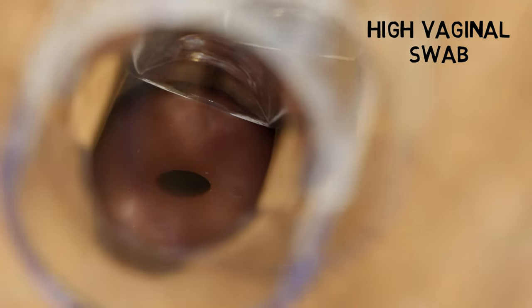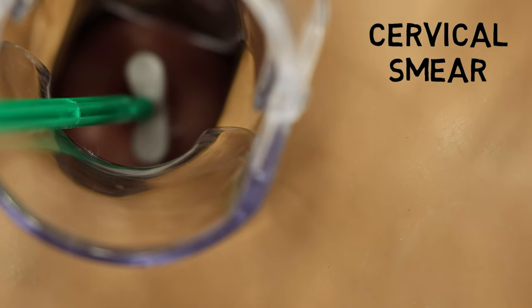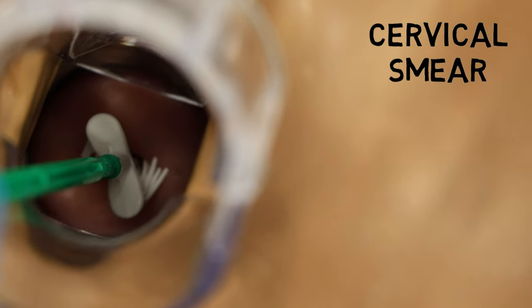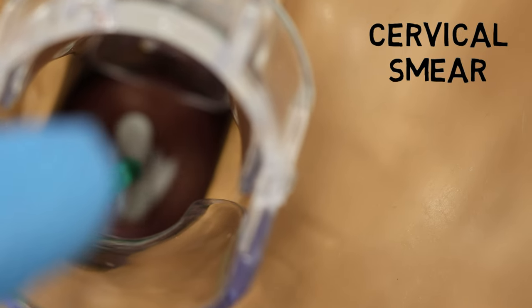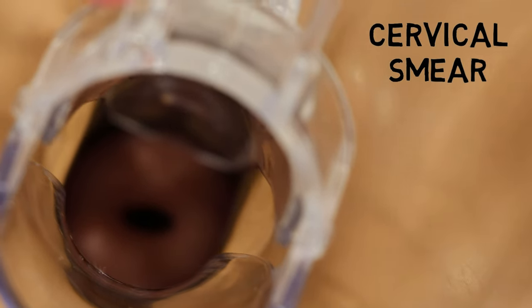Here we're taking a cervical smear using a cervical broom. The tip is inserted into the cervical os and is brushed in a circular motion over the cervix by 360 degrees for five turns. Some pressure should be applied to make sure that the cells are sticking to your cervical broom. For more information on smears, I have created a video all about this subject.